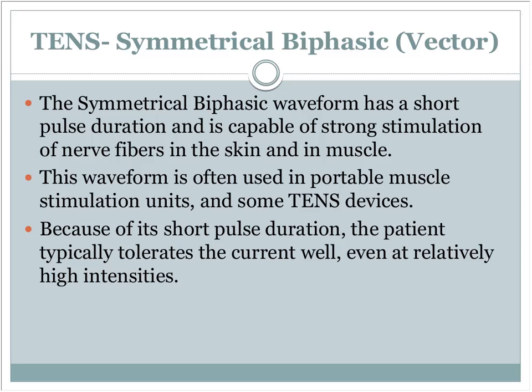And what we're looking at with this one, and everybody's kind of familiar with the idea of TENS, but it's the gate theory of pain, where if we can stimulate the large, fast, afferent nerve fibers, they will basically race up to the brainstem and into the thalamus and release a lot of neurotransmitter at that synaptic junction, so that the slow afferent nerve fibers that are carrying the sensation of pain from the site, when they get up there and they release their neurotransmitter, which is slightly different, the receptor sites are clogged up with this other neurotransmitter, and so it can't deliver that same intensity of pain, okay?